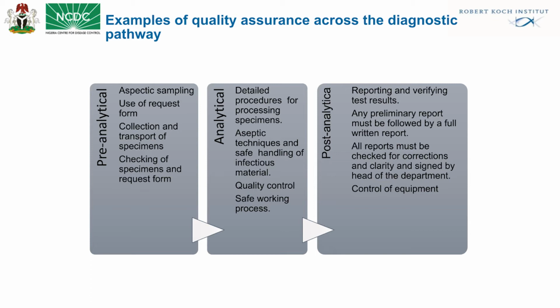And also at the analytical stage, we need to detail everything very well. The procedure for processing specimens: we have to use aseptic techniques and safe handling of infectious material. We need to include our quality control and safe working processes. We put them in place to be able to achieve accurate results.